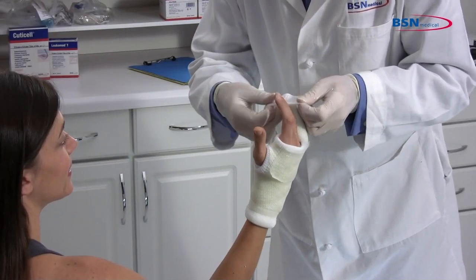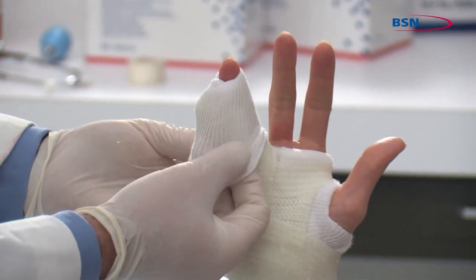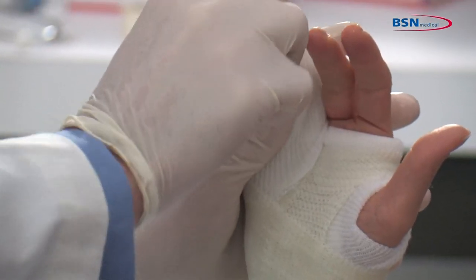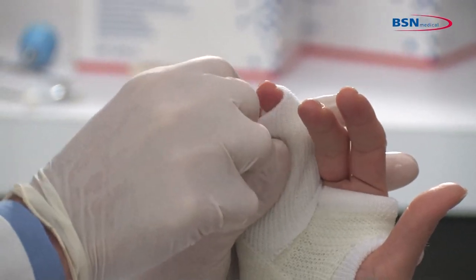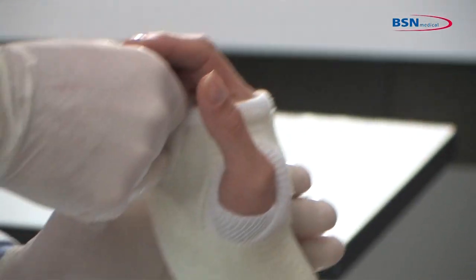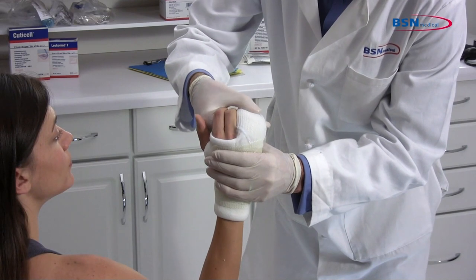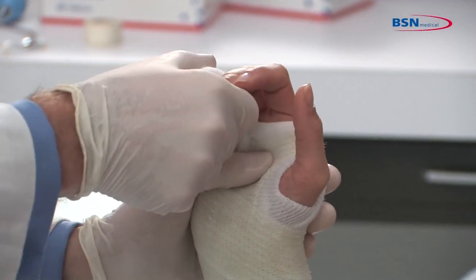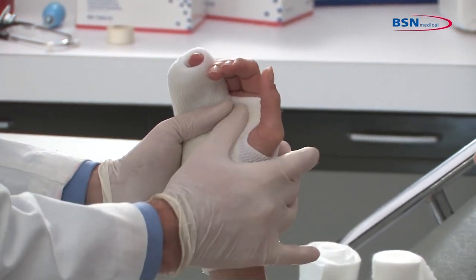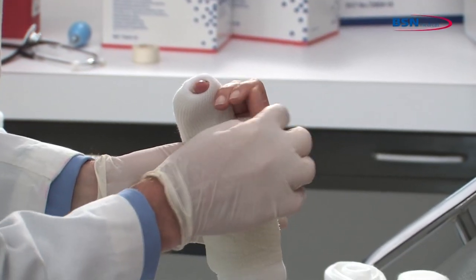Fold back the stockinette over the fourth and fifth phalange to lessen irritation on the third phalange. Make sure that the distal ends of the fourth and fifth phalanges are accessible to check on circulation. Position the fourth and fifth phalange following physician's instructions. A common position for a boxer's fracture is with the metacarpal phalangeal joint flexed to 90 degrees and the proximal and distal interphalangeal joints at full extension. The wrist may be put into slight dorsal flexion.